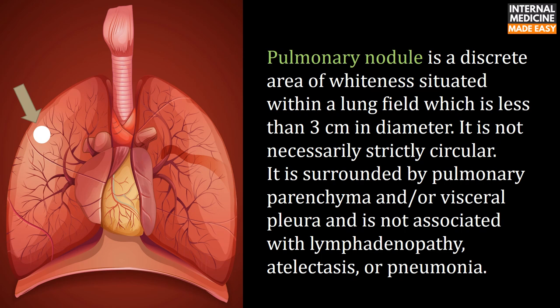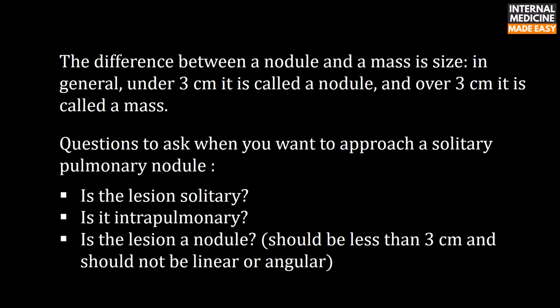A pulmonary nodule is a discrete area of whiteness situated within a lung field which is less than three centimeters in diameter. It is not necessarily strictly circular, is surrounded by pulmonary parenchyma and/or visceral pleura, and is not associated with lymphadenopathy, atelectasis, or pneumonia.